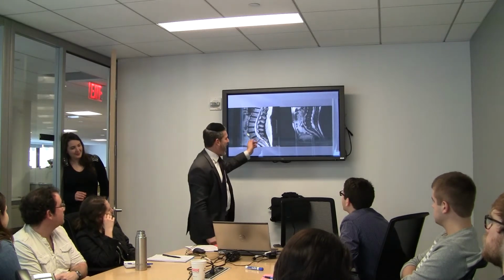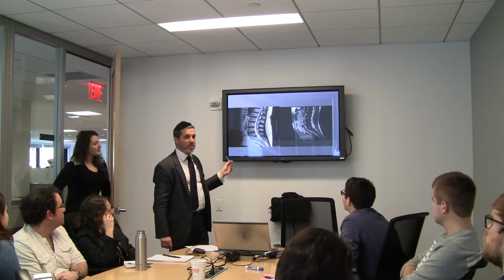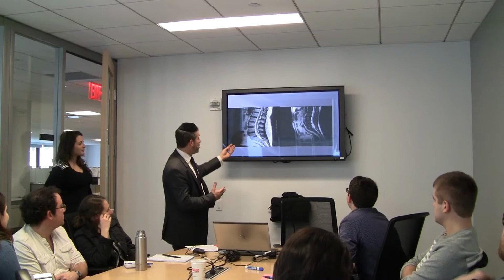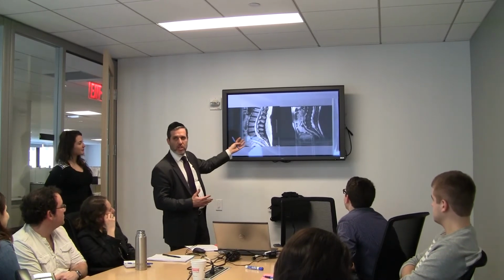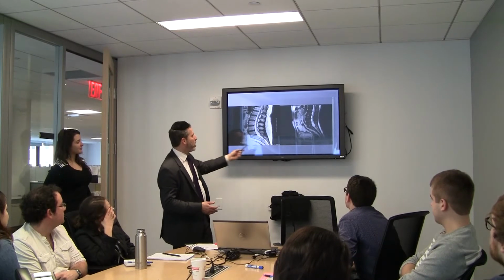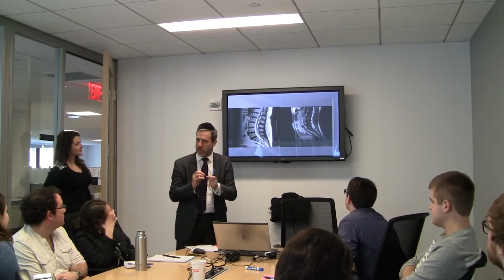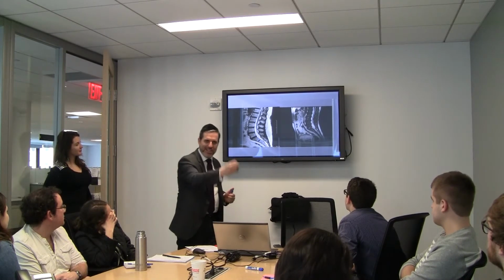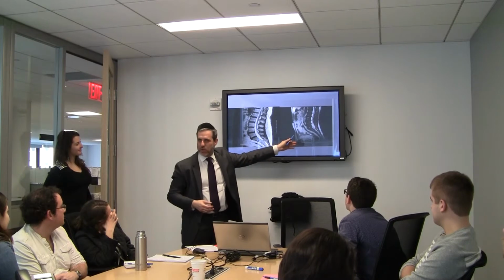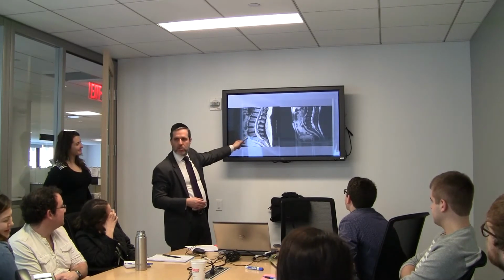And I've rigged it a little bit, but one of these studies is a high quality study and one is a lesser high quality. And you can see there's a difference. If you're a physician, if you're in a carrier and you're looking to make a determination as to which of these two studies you want to do. Now, by the way, I didn't purposefully rig it. I tried to Google bad lumbar image MRI, and I had to fish for it. Nobody's really promoting bad images. They like to show you something like this, right?